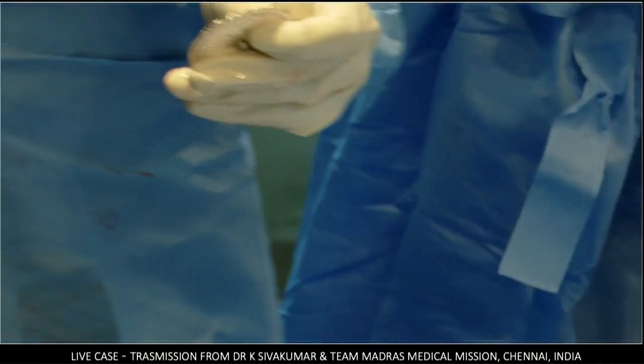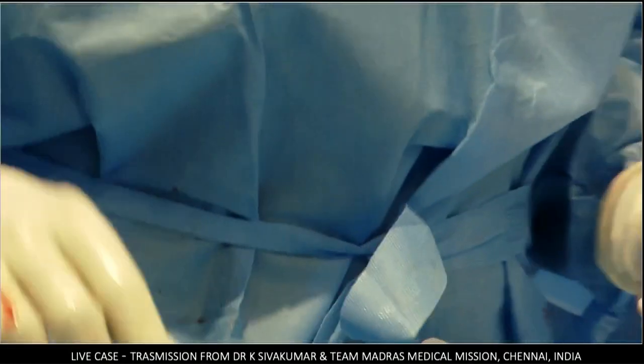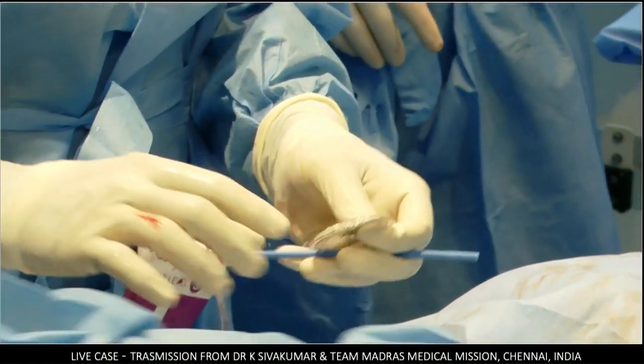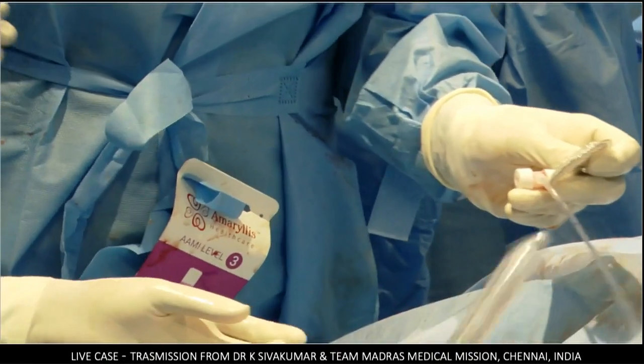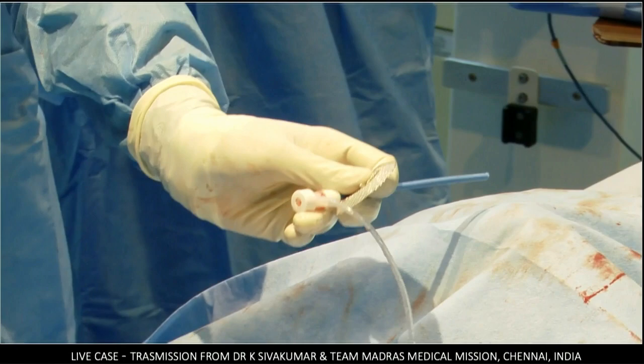Now, I want the short loader sheath. And I want the LifeTech loading cable. Somebody measure it, please. LifeTech loading cable. Loading.